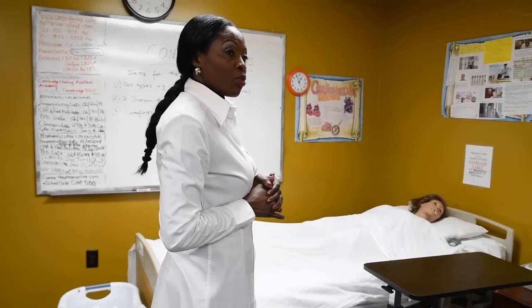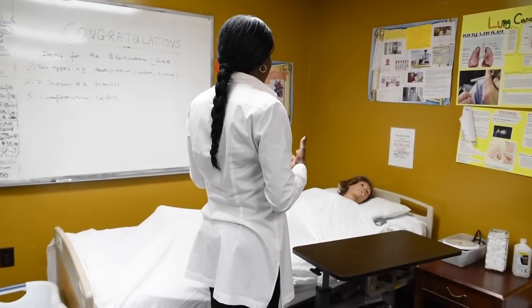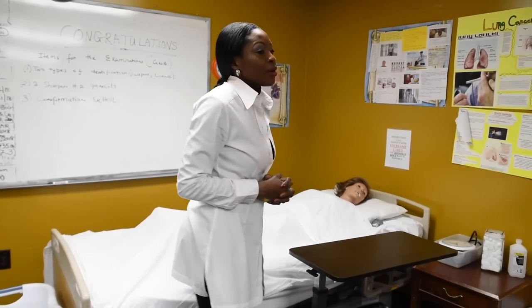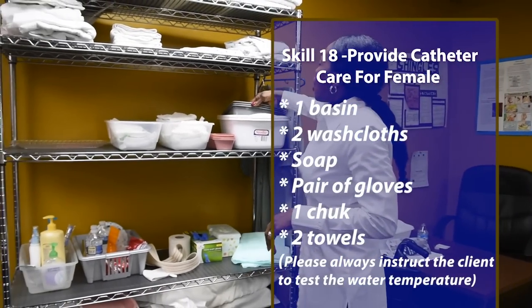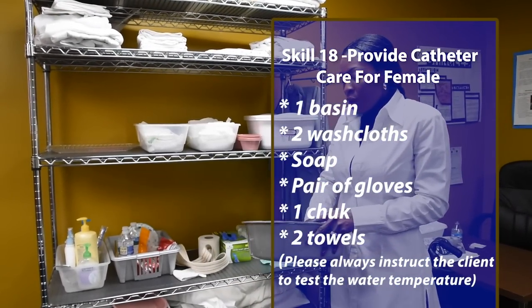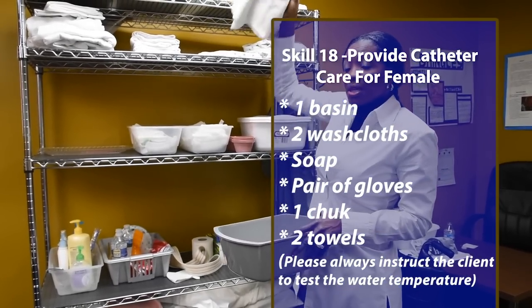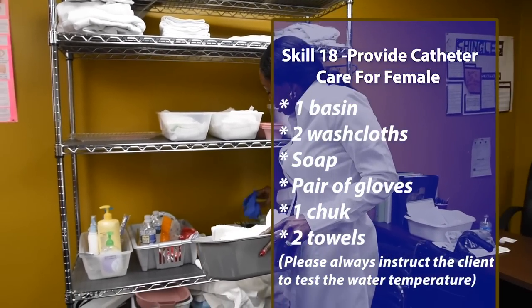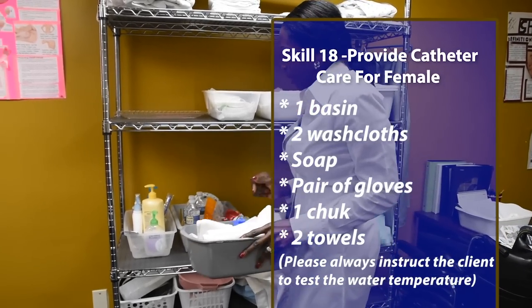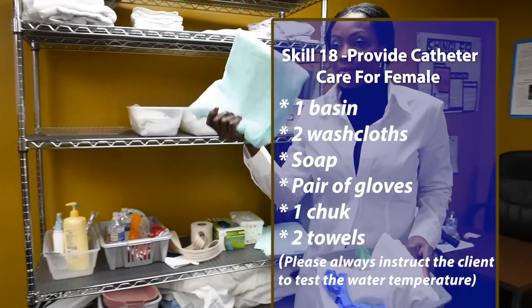You go to Miss Susie once again. Hi, Miss Susie. My name is Cynthia, and I'm here to perform catheter care on you. Write this down as your equipment, okay? One basin. Two washcloths, two towels, pair of gloves, soap again, and chuck.